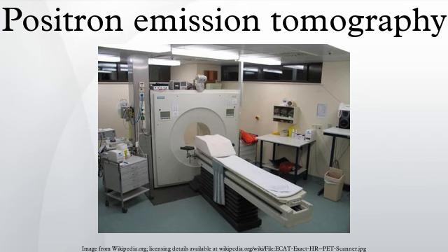Limitations to the widespread use of PET arise from the high costs of cyclotrons needed to produce the short-lived radionuclides for PET scanning and the need for specially adapted on-site chemical synthesis apparatus to produce the radiopharmaceuticals after radioisotope preparation. Organic radiotracer molecules that will contain a positron-emitting radioisotope cannot be synthesized first and then the radioisotope prepared within them, because bombardment with a cyclotron to prepare the radioisotope destroys any organic carrier for it.